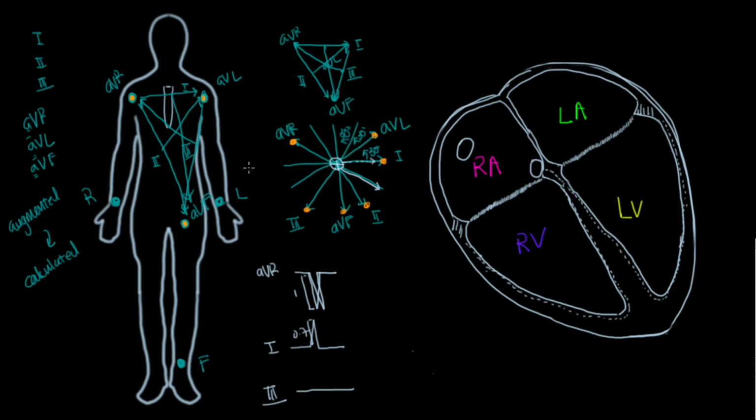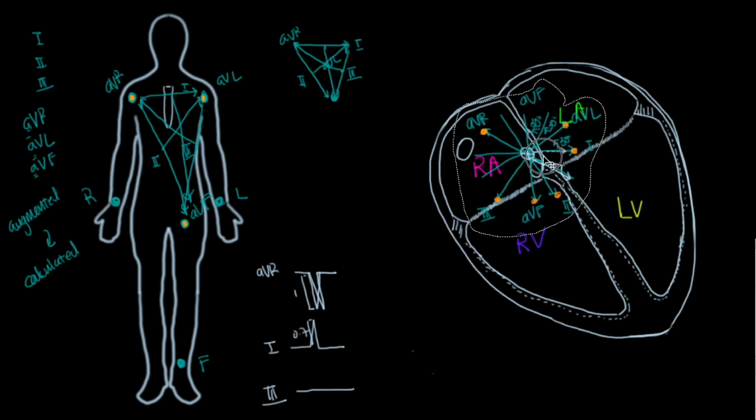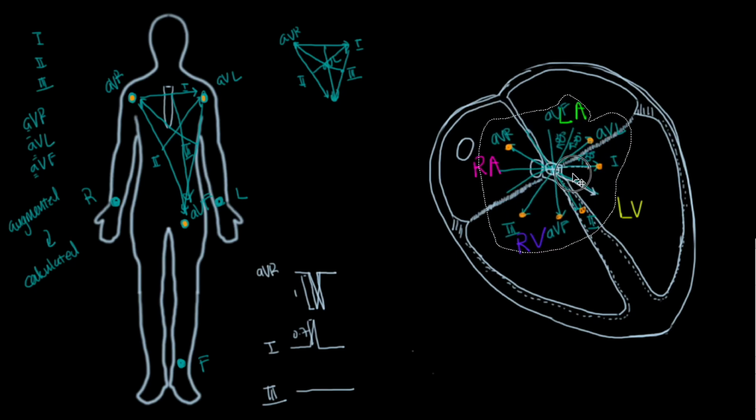Now it's nice and all that we have this thing represented right over here on our body, but what we're most interested in is seeing how the electrical signals move through the heart. So as we move forward, we're going to see how this thing would actually be better suited to represent as kind of imagining it somewhere around like here. And remember, these vectors can be moved.